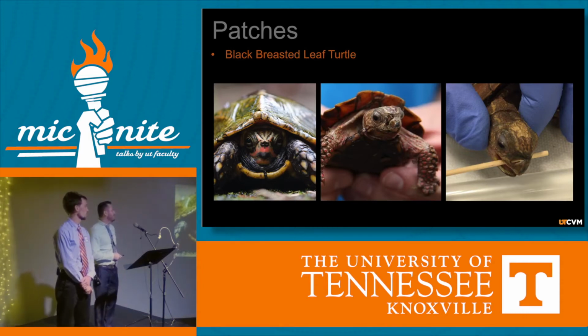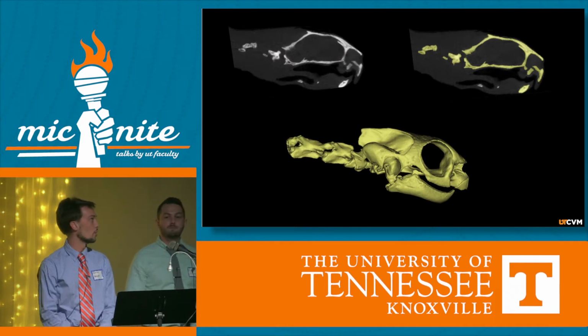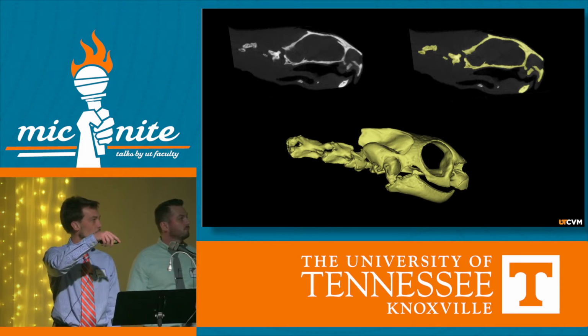And so the zookeepers came to us and asked how do we evaluate this further and what can we do to kind of fix it? So the best way we have to evaluate the defect is to put Patches into a CT scanner, the same way you would undergo. On a CT scan, you have a black and white picture like that. We take that picture, put it into computer software where you isolate the bone, and we get a 3D model.